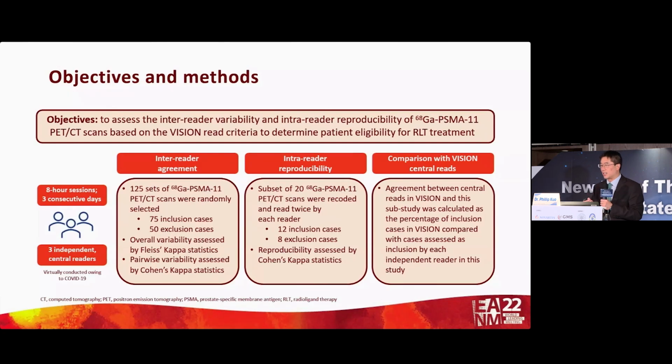And this is important because, as any nuclear medicine person will tell you, it's easier to see PET positive stuff than PET negative stuff, okay? So we actually enriched it in a way that made this a harder study to read than in real life. We did an intra-reader component, so we showed them some of the same scans over, but I won't go over that in the interest of time.